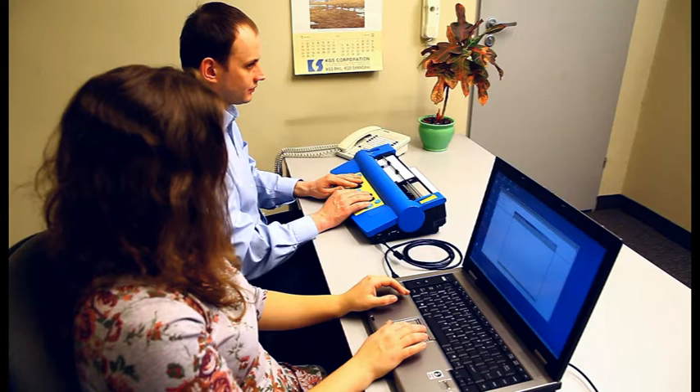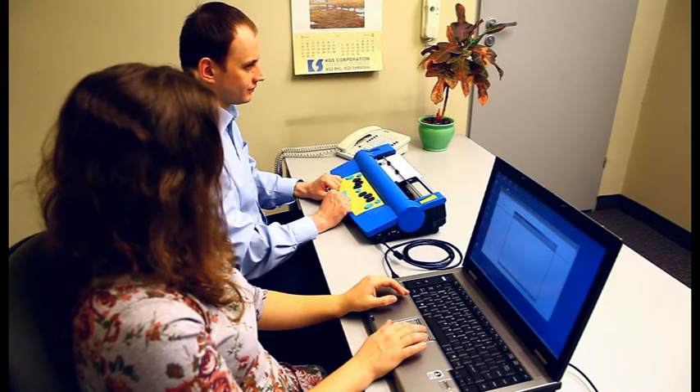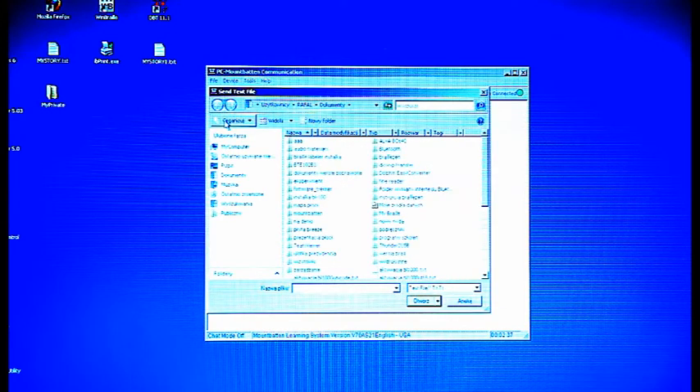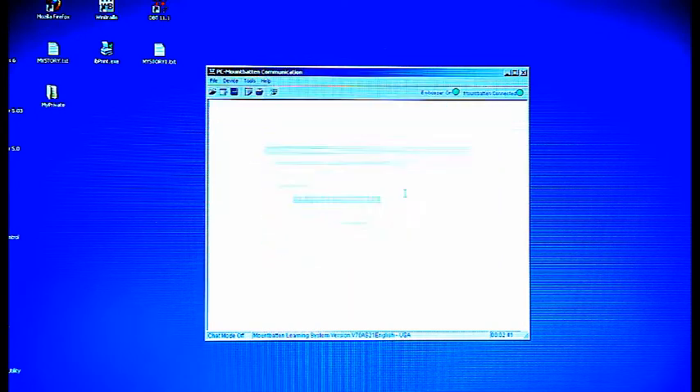Press OK and the file will be embossed and copied to your Mountbatten. The Emboss File option allows you to emboss documents saved as text files without saving them in the Mountbatten's memory. In the File menu, find the Emboss File on Mountbatten option. Select a file, click OK, and your file will be embossed.